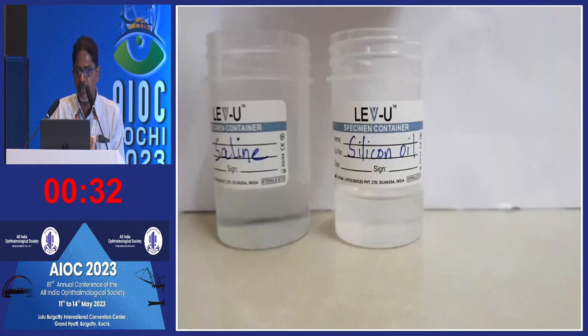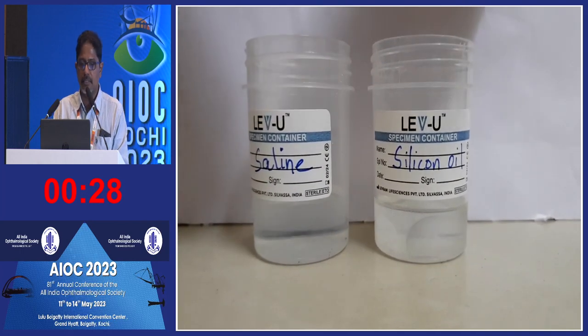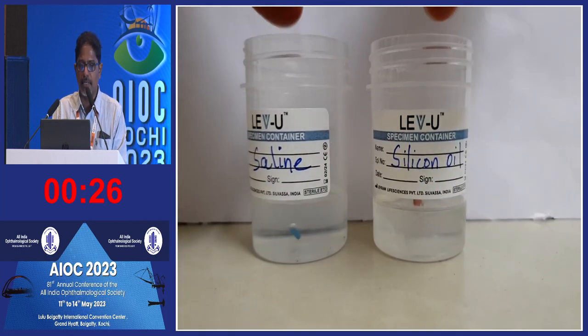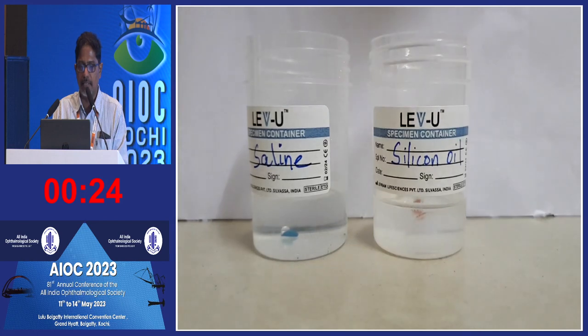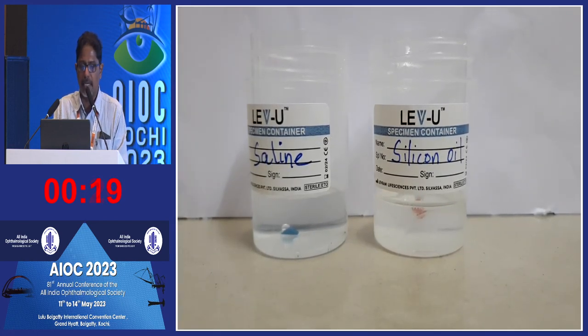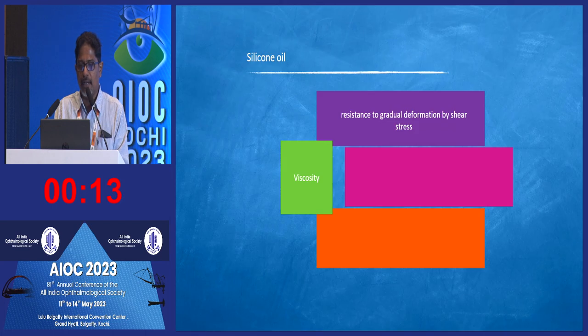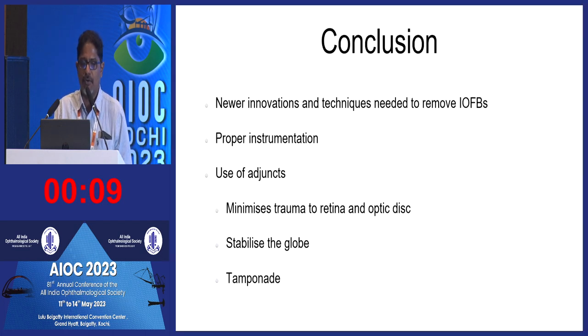Unlike PFCL, it has a little bit more viscosity. You can see here a foreign body being dropped in silicone oil and in the vitreous with routine BSS. PFCL is a little more viscous than saline, in between saline and silicone oil. So oil gives you much better viscosity to keep the globe intact. And there's one thing you have to keep in mind when you're dealing with large non-magnetic foreign bodies.